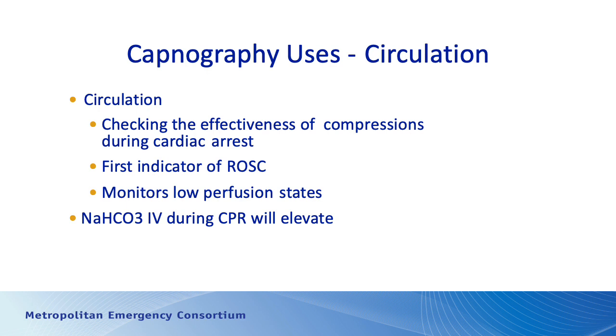So just be careful. If you give the patient a dose of sodium bicarb and all of a sudden capnography improves and goes up, the question is, do they have ROSC, or is it just a manifestation of your bicarb use?